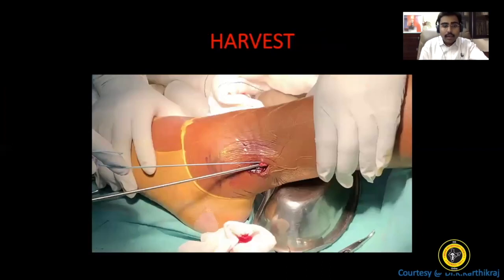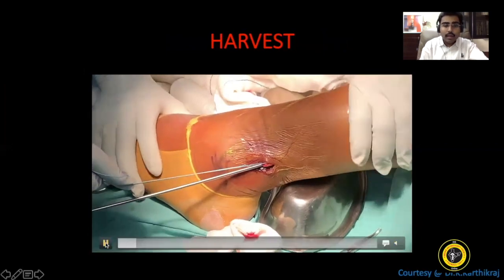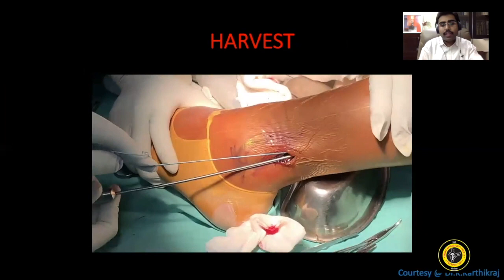The last one is the harvest. I used a closed tendon stripper, pushing the tendon stripper across and giving a gentle pressure over the whip stitches.